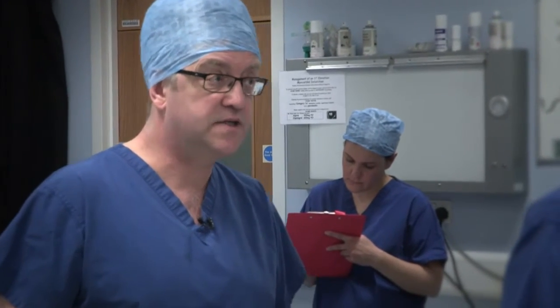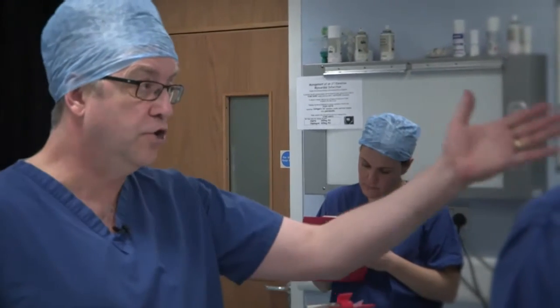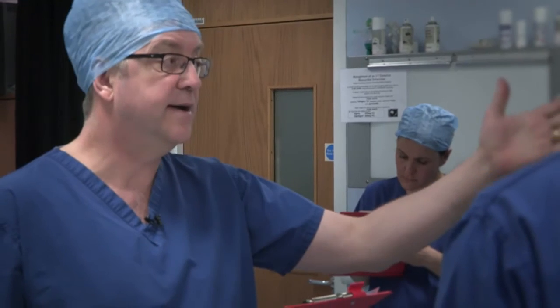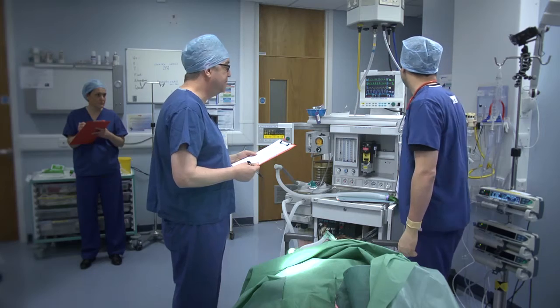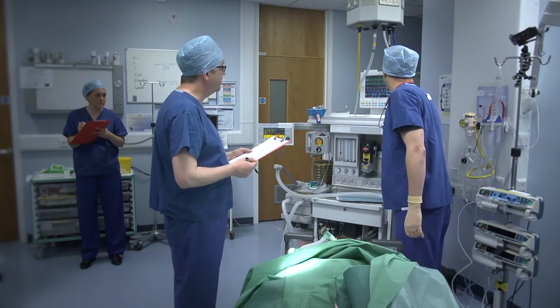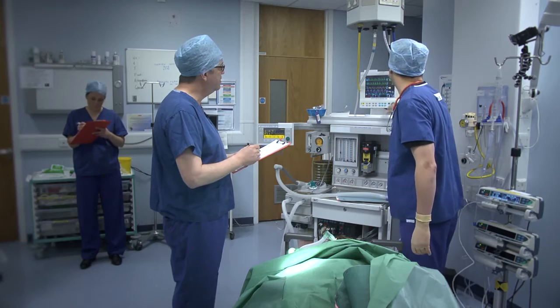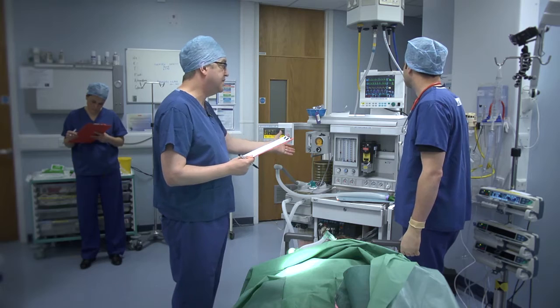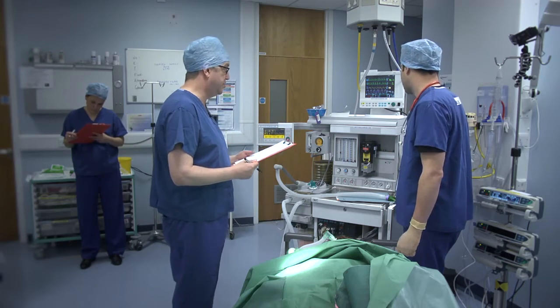What I would like you to do now please — could you please look at the patient monitor and tell me if you notice anything? Yes, the oxygen saturation level has come down. Could you now please adjust the oxygen?